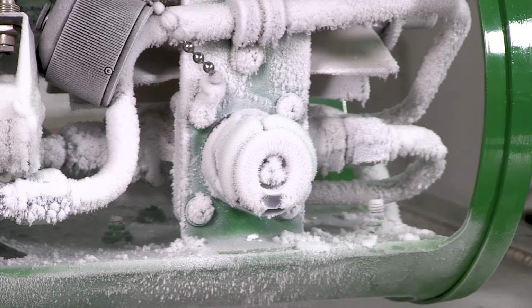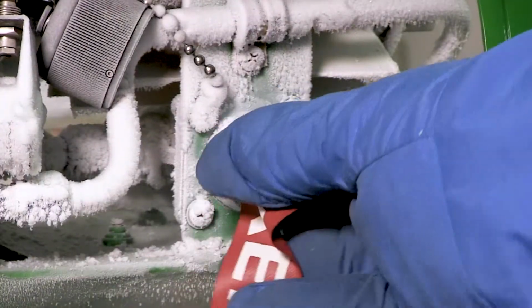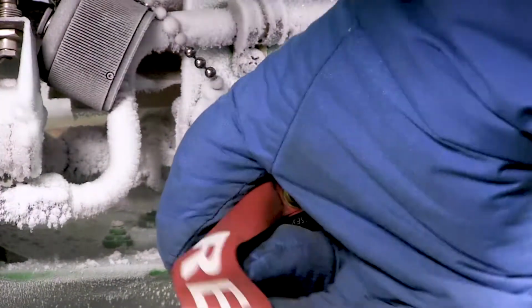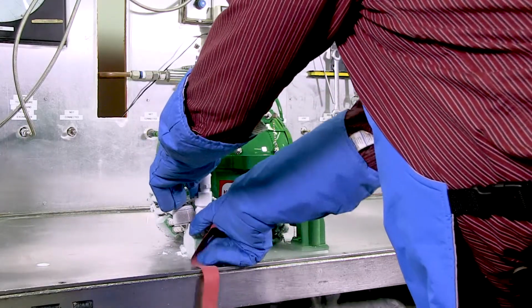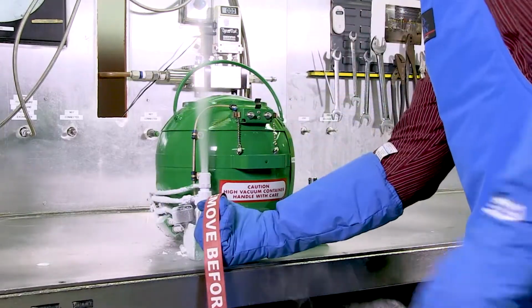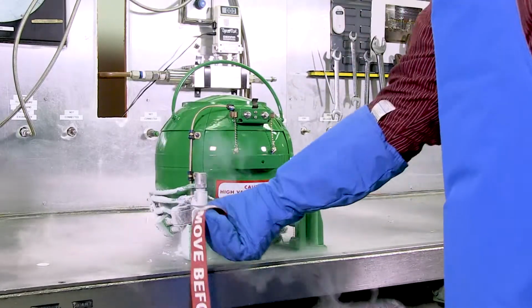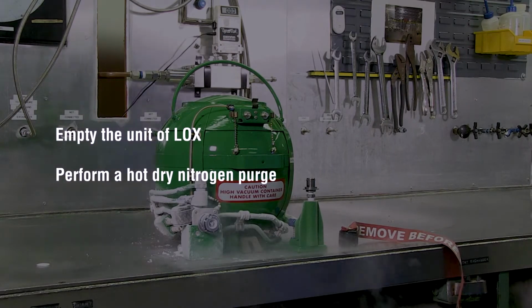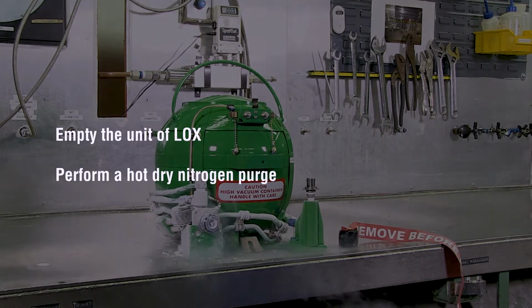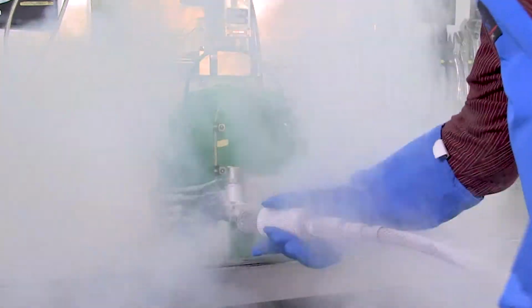If you suspect ice or foreign object debris, FOD, is present in the valve, first clear the fill port, then use a vent cap to clear it out, and to reseat the poppet in the valve. Quickly insert the vent cap into the valve, turn it clockwise, and then remove it. Repeat the process until the FOD is cleared. If this does not correct the issue, empty the unit of LOX and then perform a hot, dry nitrogen purge on the unit. After the nitrogen purge, refill the unit with LOX to see if the issue has been fixed.